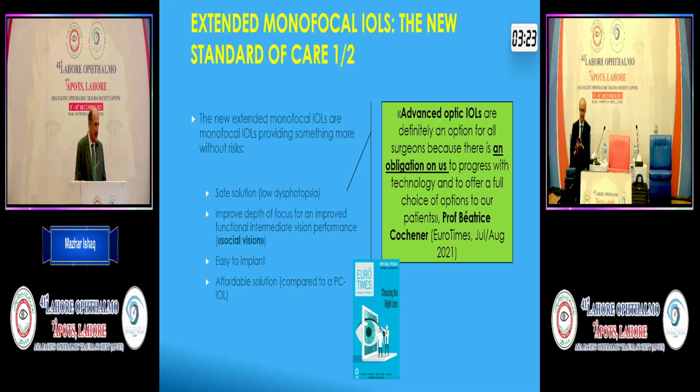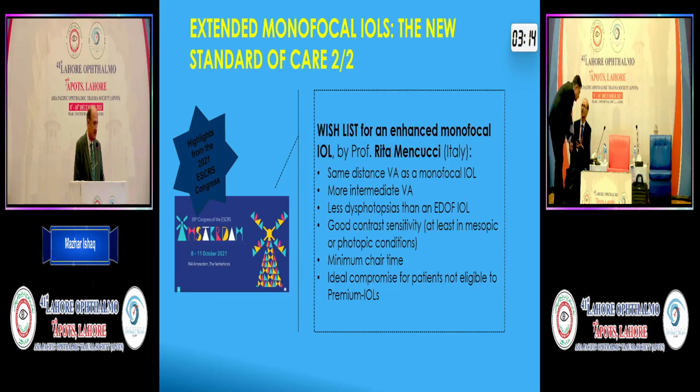And the extended monofocals are the ones which have come up, which are basically a monofocal lens without the risk of problems regarding dysphotopsia, along with the glare and night vision problems.